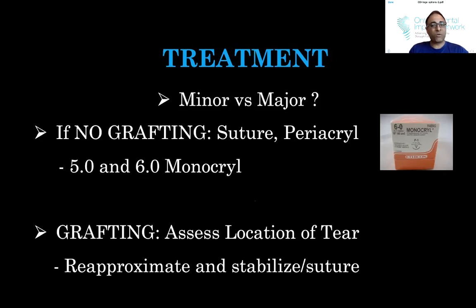Some would use Periacryl, but I hesitate with Periacryl because if it's a larger area, the Periacryl can get inside the site and cause a foreign body reaction. So be mindful, assess it, and ask whether you need to use it. Remember, a suture is to reapproximate. So if the flap is sitting there and it's got a bit of a tear that's nothing overly concerning, sometimes nothing is better.